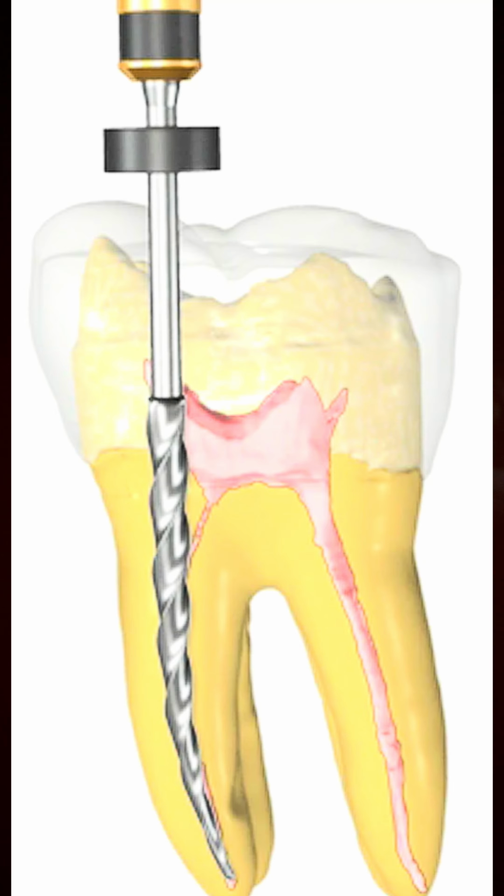Phase 2 is coronal pre-enlargement, which is orifice enlargement. It is a concept of enlarging the coronal third of the root canal prior to the estimation of working length. The working length of the tooth should be determined only after this procedure is completed.